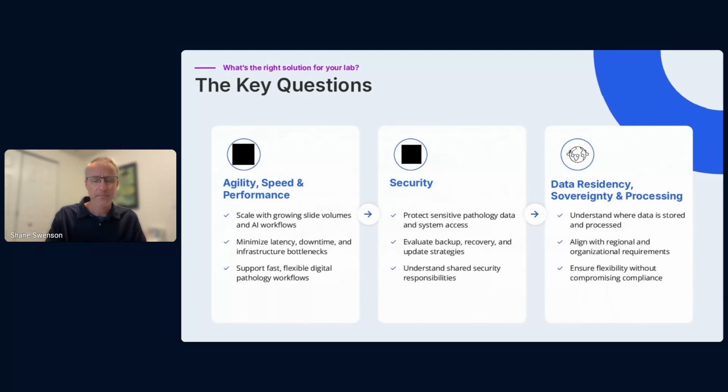And so you may have regulatory restrictions that say it has to be in a particular location, but it may be that there's actually a path to the cloud. Most of the jurisdictions we've looked at do have valid cloud-based options available to them. So again, this is something that needs to be solved, but it doesn't have to be a blocker for using a software as a service solution.